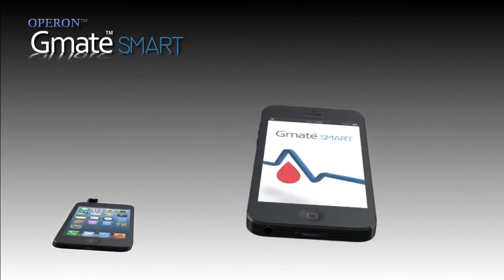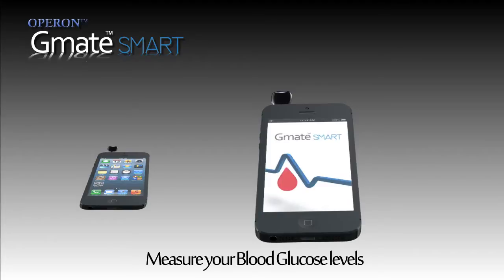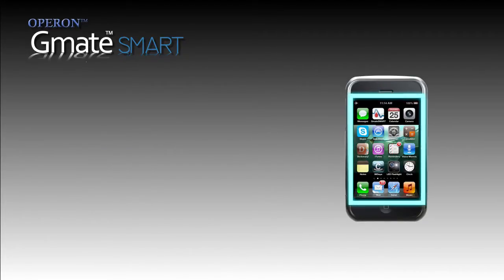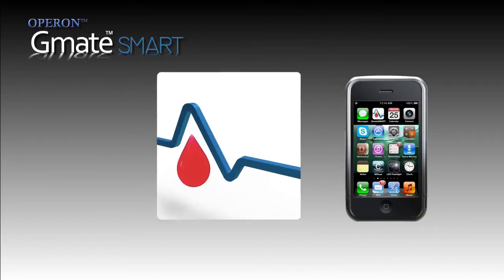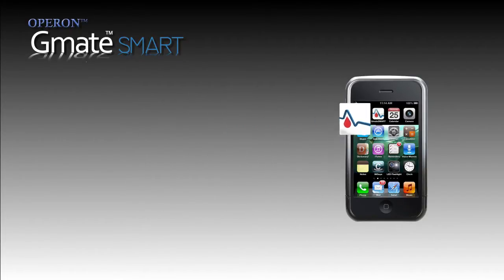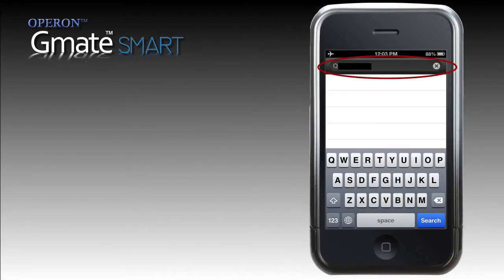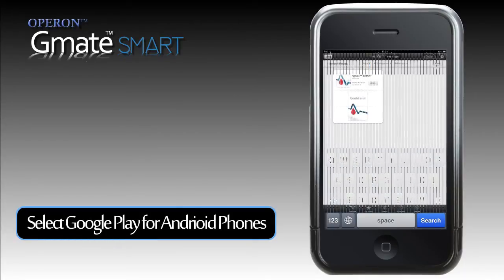GMATSmart Blood Glucose Meter combined with your smartphone can be used to measure blood glucose levels. It uses the operating system of your smartphone and the app through which the GMATSmart Meter works is free to download. Use 'GMATSmart' to search under the application store for Apple products and Google Play for Android platforms.